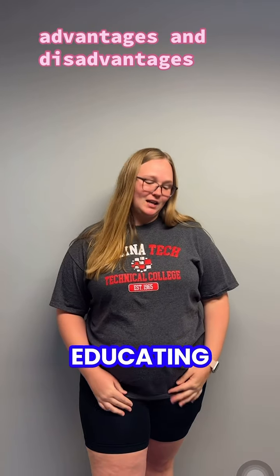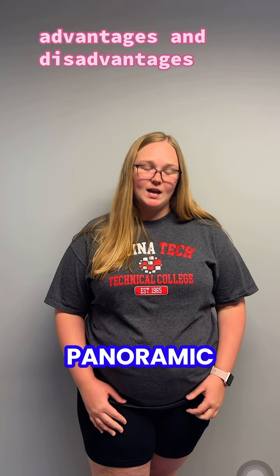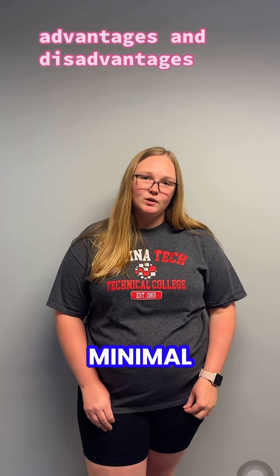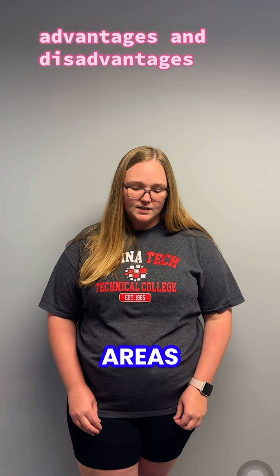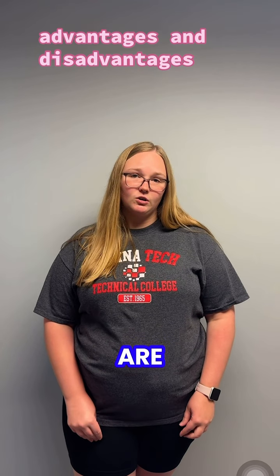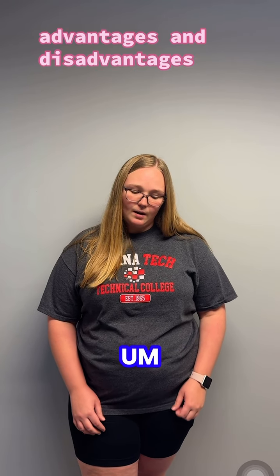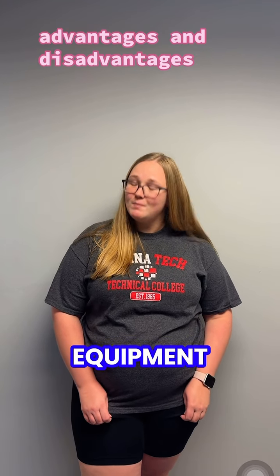So I'm going to be educating you on advantages and disadvantages. Some advantages of panoramic imaging are that it's simple, minimal exposure, large surface area, and patient acceptance. Some disadvantages are images aren't sharp, you can't diagnose decay or periodontal disease, distortion, and the equipment is expensive.